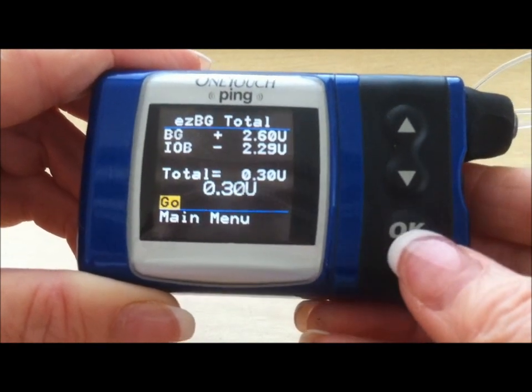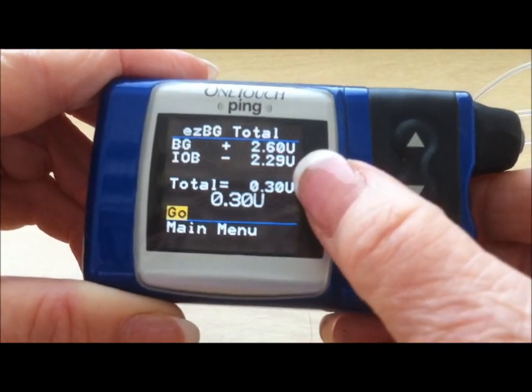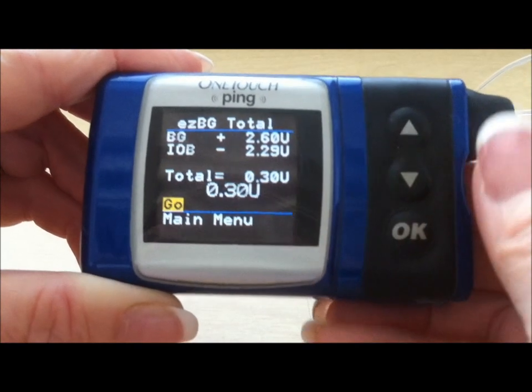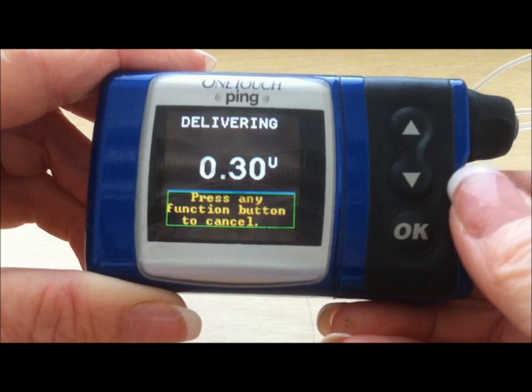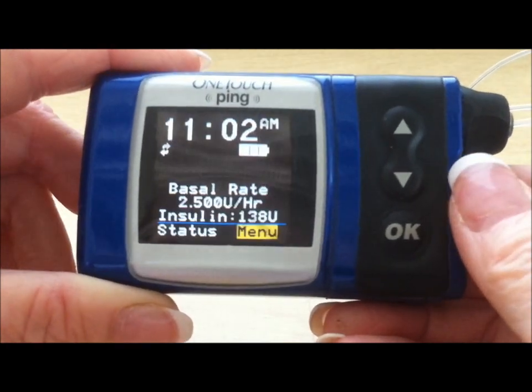Stop at go. Double-check that the recommended amount and the amount that you want to take are the same. Press the go button, and again the insulin is delivered.